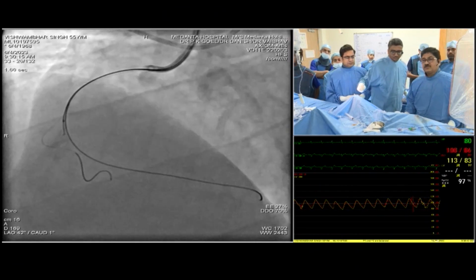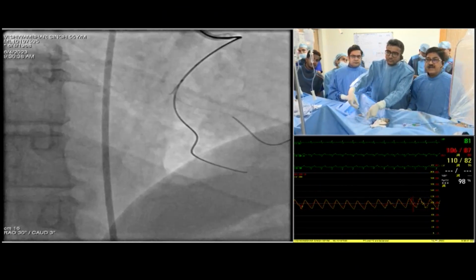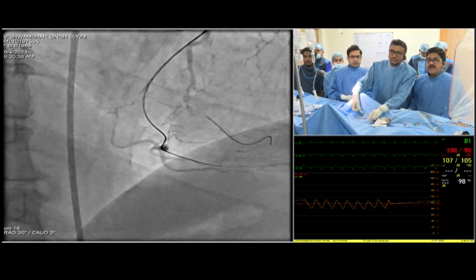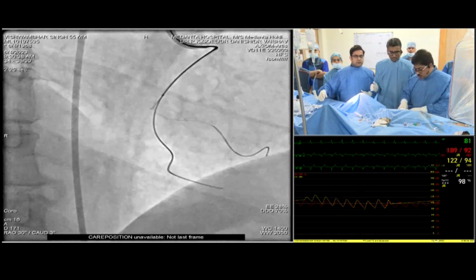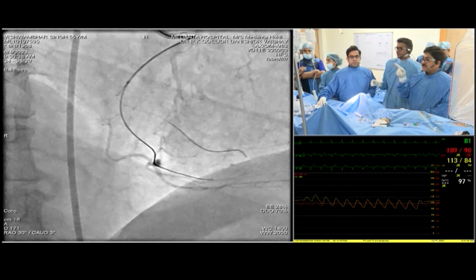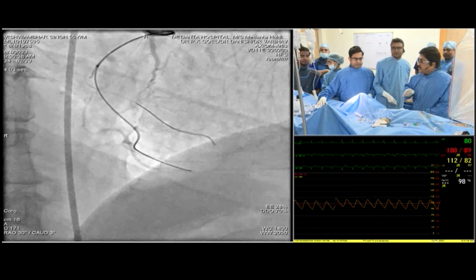Dr. Nagamatsu, one question. Do you think the first wire crossed correctly, punctured using IVUS? Left injection, RAO. I don't think so. The penetration with the first wire was not correct. IVUS is absolutely correctly punctured, anyone who's wanting to learn must understand this is the absolutely correct puncture of the IVUS. No, but I don't deny that. Okay, sir. So you have to understand.